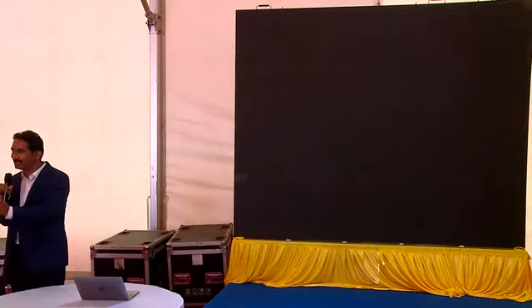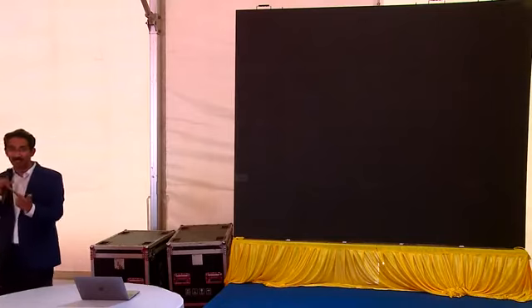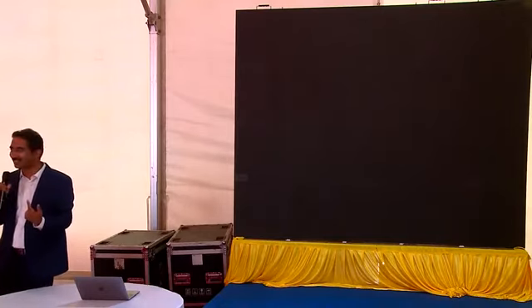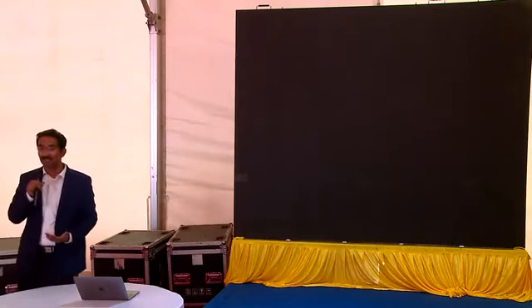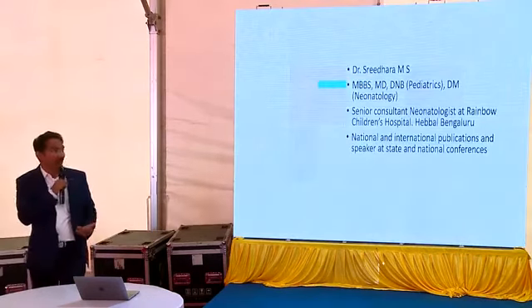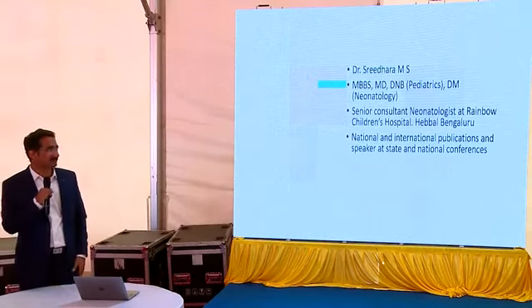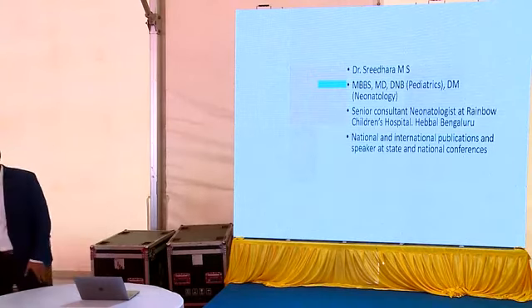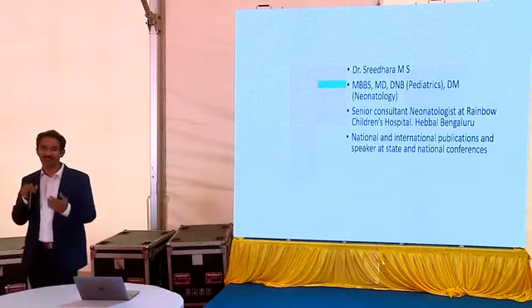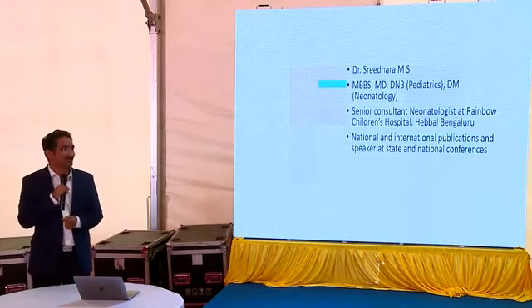Okay, check for air entry, she says. Excellent. He wants to check for hypoglycemia, hypothermia. Okay. Anything else? Good. We are on track. She wants to see if the tidal volume is being delivered or not on the ventilator. We need to check for DOPE. Okay. Good. So how are we going to do it? Examining the baby. Good. So we are on track.